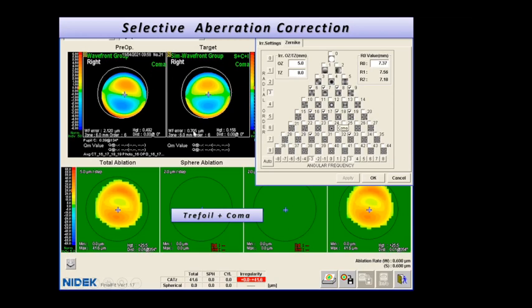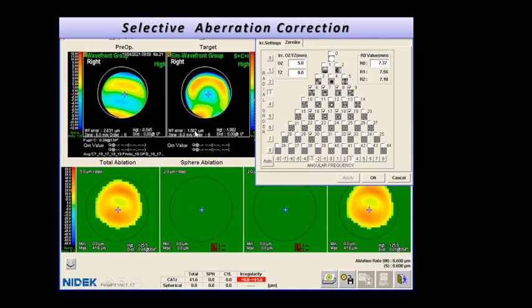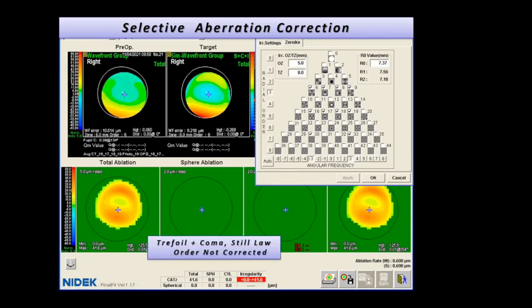Oh my God, look at the beauty here. So only by 41 microns, I could change the coma from 2.1 to 0.75. And this is total higher order aberration, 2.6 to 1.5, again, beautiful. But you may ask me, what is this? This is the total aberration. Total aberration means high order as well as low order. You will notice that it was 10 becoming 6. So you may say, why did we leave so much?